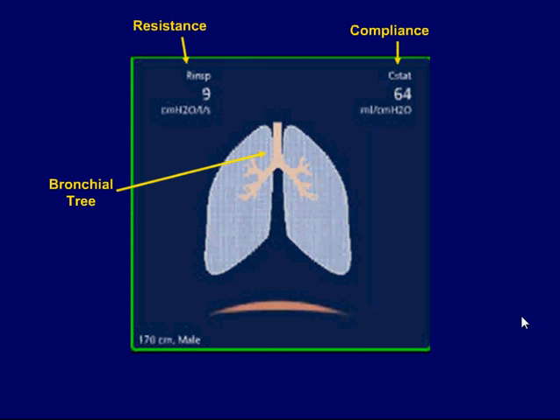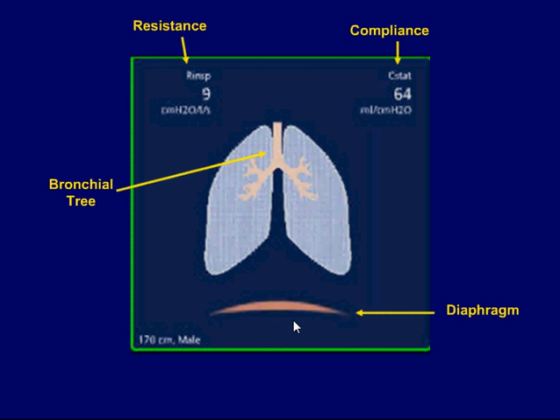It also gives a visual representation of those values. I have a bronchial tree and it's nice and pink, which is normal. However, if the resistance was higher, it'd be a different color and narrower. When the patient is spontaneously breathing, you can see the diaphragm. If you have the end-tidal CO2 software, you'll have an end-tidal CO2 measurement between the resistance and the compliance.